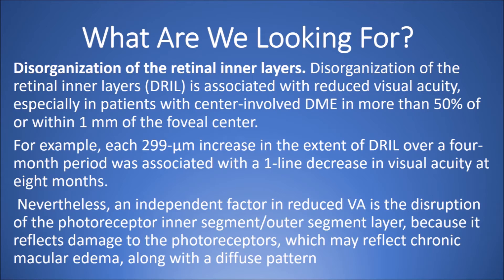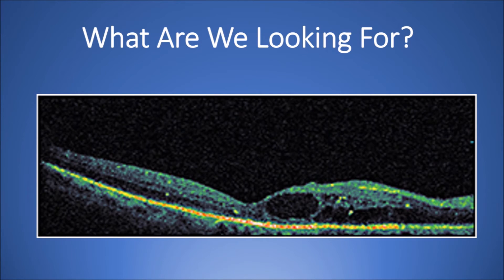An independent factor in reduced vision is disruption of the photoreceptor inner segment-outer segment layer, because it reflects damage to the photoreceptors, which may reflect chronic macular edema along with diffuse atrophy. Here is an example of a cross-sectional OCT image that shows disorganization of the retinal inner layers with a large cyst and disruption of the photoreceptor inner segment-outer segment layer. This patient may not have an excellent prognosis after treatment.